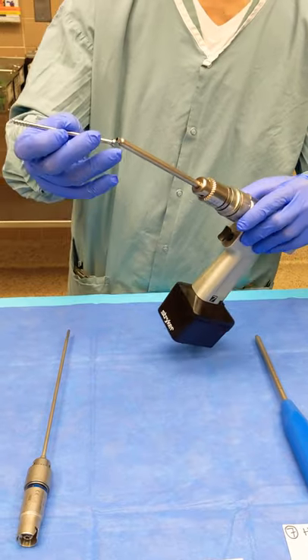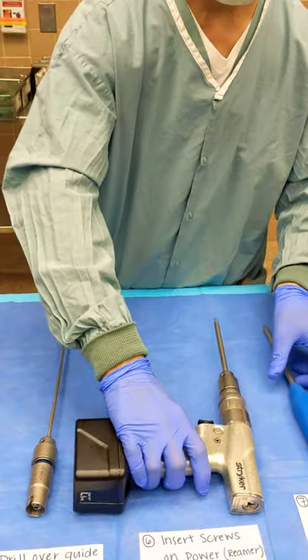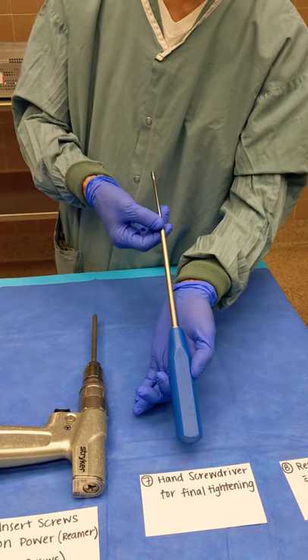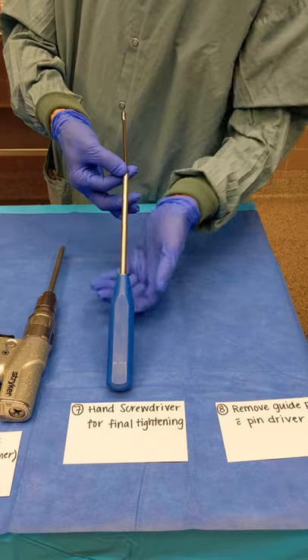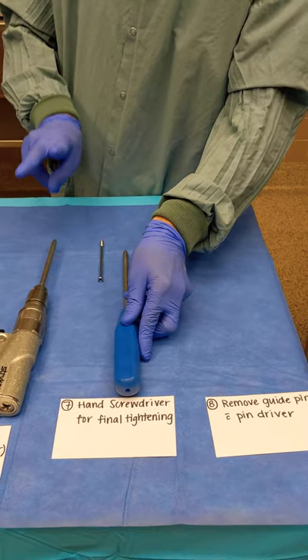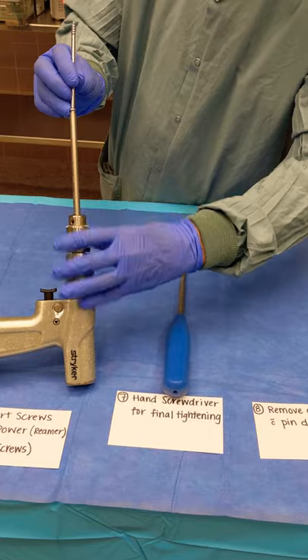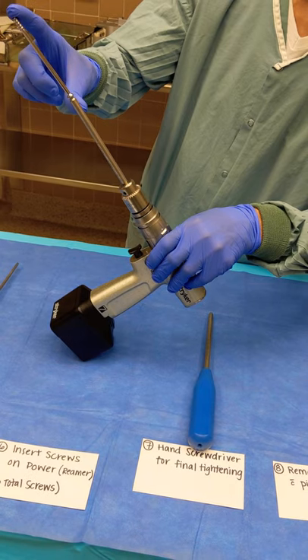We'll drive this down probably about 90% of the way into the hip, into the bone. Then you'll hand up the manual screwdriver for step seven, and they'll finish tightening that up by hand so the surgeon can feel through proprioception that it's at the right position. They'll take some images as well to make sure it's not too long or too short. They're going to repeat that process two more times for the other guide wires. They'll call out the screw lengths they want — usually giving you all three lengths so you can have those screws ready to go.